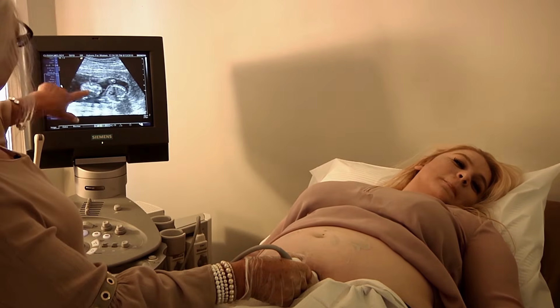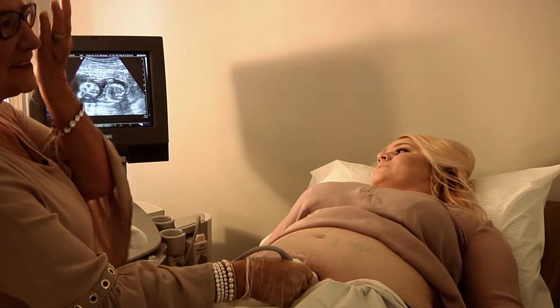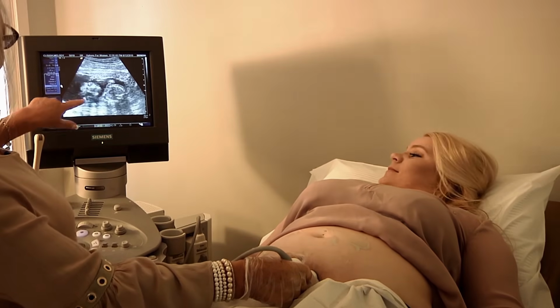And that's how you get your 3D image, just by cutting through the skin like that. Do you see how I do that? Just.